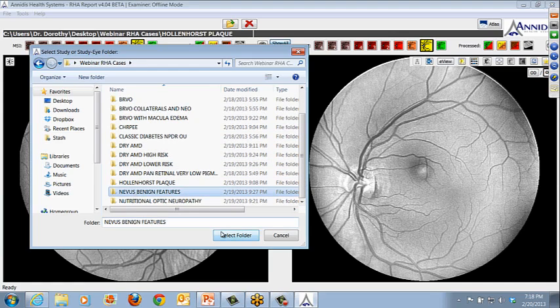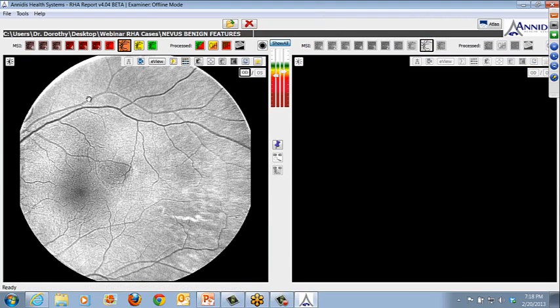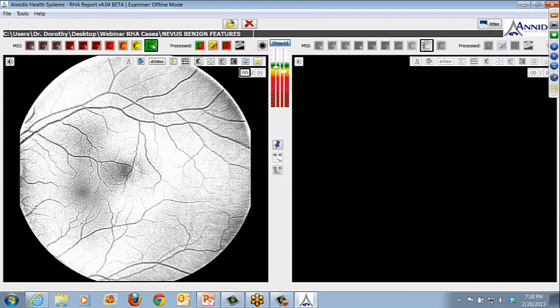So I'm definitely going to pull up a nevus here and just one eye. And this is something that I think is a very useful tool with multispectral imaging, is helping further differentiate, but also importantly follow nevi over time. Okay, so there's a lot of controversy in the literature, despite the fact that we have the ocular melanoma study and some other large scale level 1 studies that have nicely sorted out what features constitute malignant features and what are the things that we should look for in following nevi over time.